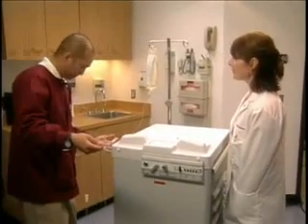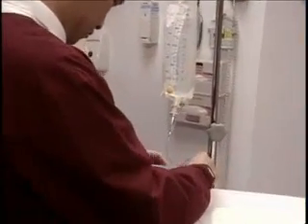All set. Okay, great. Now we can take it to your patient. Just be sure to label the new tubing with date and time information, and we're good to go.